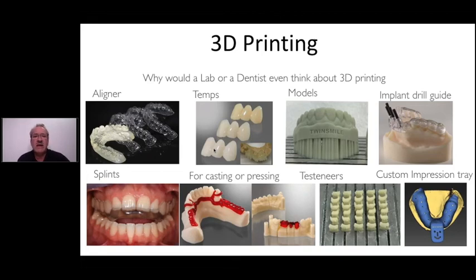It takes about 15 to 18 minutes to print a 3-unit bridge, a single crown, or 10, 14-unit bridges. So the time doesn't matter because it's the height of the object you print. And the quality which we get with materials, we are using a material called Twin Smile, which is really fantastic. We get beautiful shades, they look good in the mouth, and we can also make very nice mock-ups. So we have lots of possibilities.